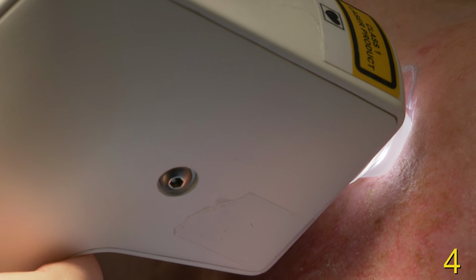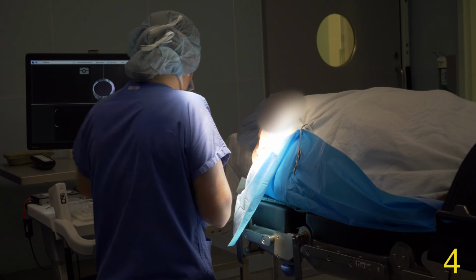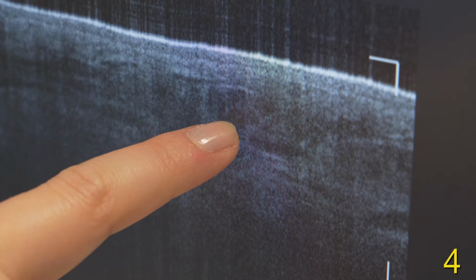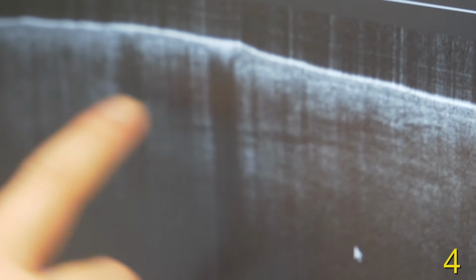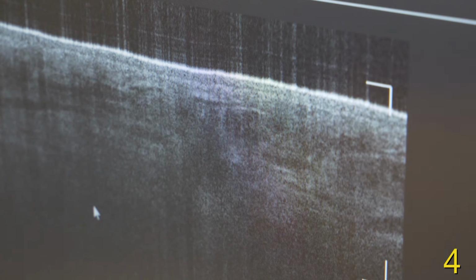And now you really have to pressure it again on the white line, and there we also see some nodules. I can show you where the nodule is. You can see here. This is still some residual BCC tumor, and it's not inside the line. Here is the line. The line is over there. Okay, here's the shadow in the image. Yes, this is the rest of the tumor, and this is the healthy tissue, but it's not healthy. Here you can see a nodule again.